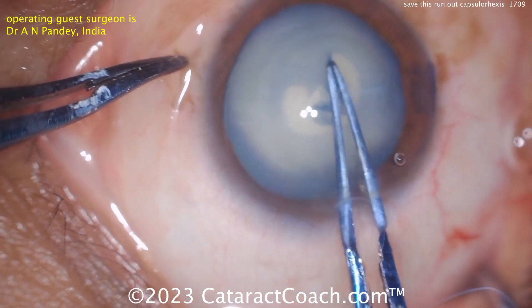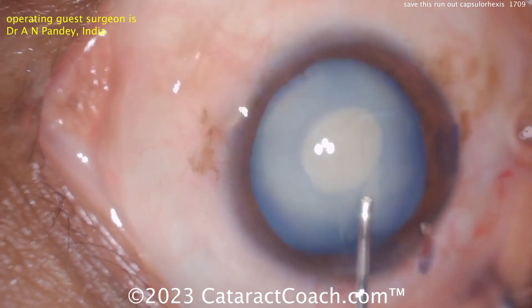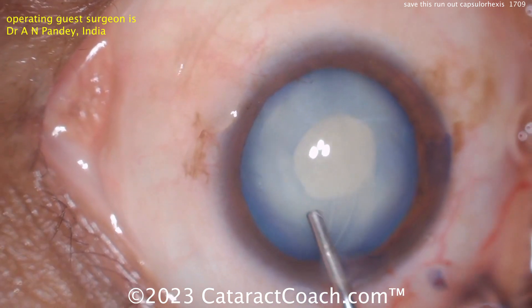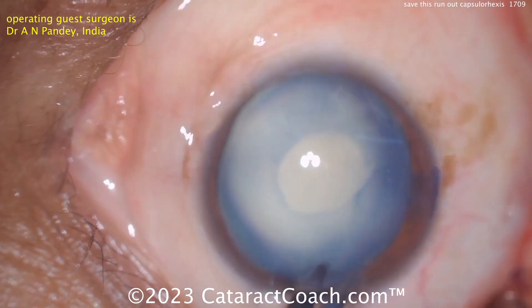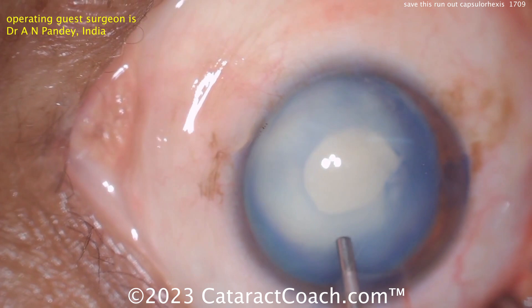The double rexis technique always works well — complete it. Now what you can do is really rock that nucleus, do some gentle hydrodissection to flush out any liquefied lens cortex that's behind there, and really decompress the capsular bag.